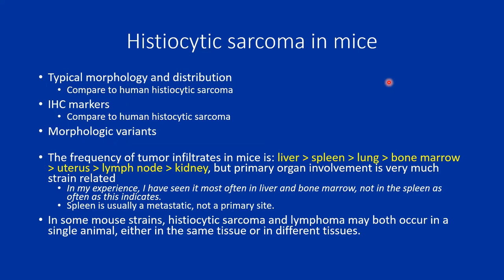Histiocytic sarcoma, as far as frequency in different organs, tends to be most common in the liver. According to the INHAND publication, it's liver, spleen, lung, bone marrow, and some other organs. What I'll be showing mostly are images of the liver. When it is in the spleen, it's usually metastatic and not primary, but it does vary strain to strain.